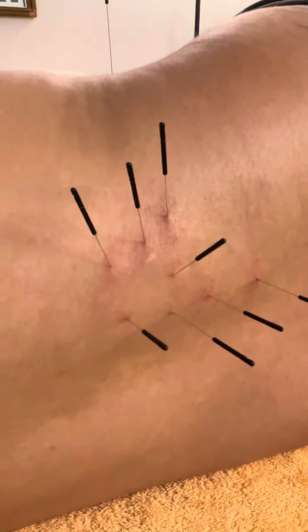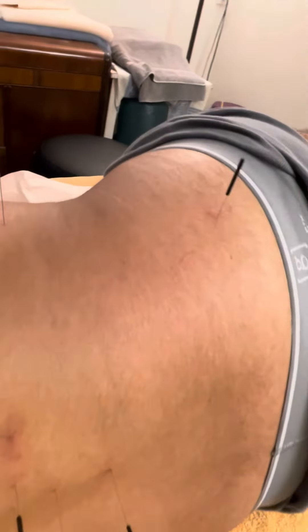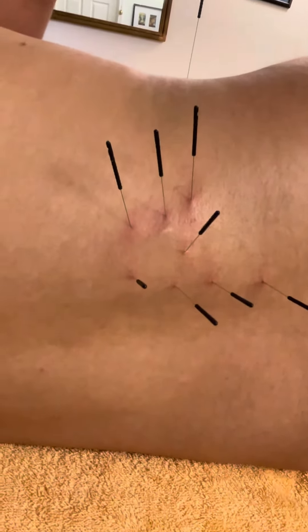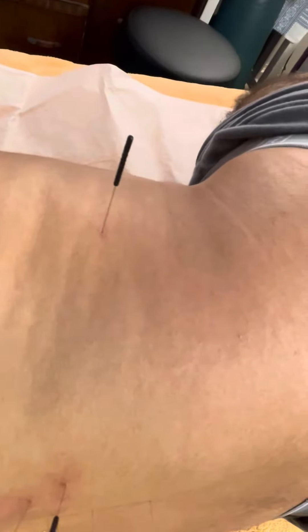Okay, that was a good one. We're all done with those. I'll just go to this gluteus medius point and see — is that okay? Yeah. Do you feel it moving? I feel it moving. So that's the goal here, to have you feel it move. That's the gluteus medius, the quadratus lumborum, and the perivertebral muscles on the right side, which is where all of your pain is. And this is the fascial sheath between the rib cage and the pelvis.